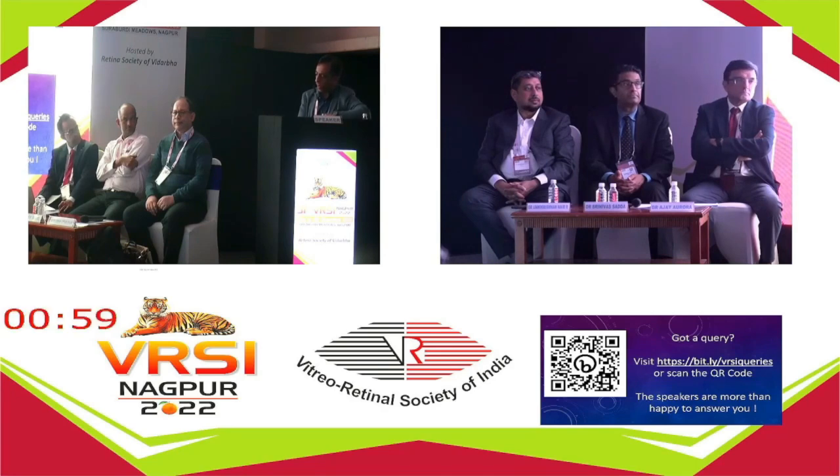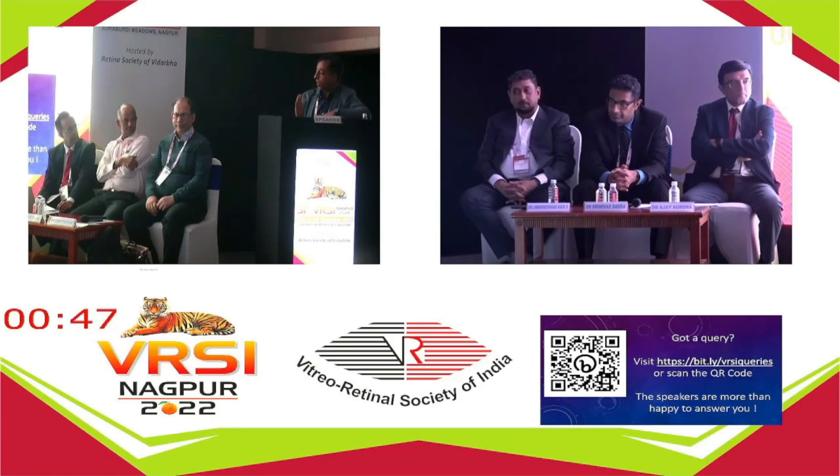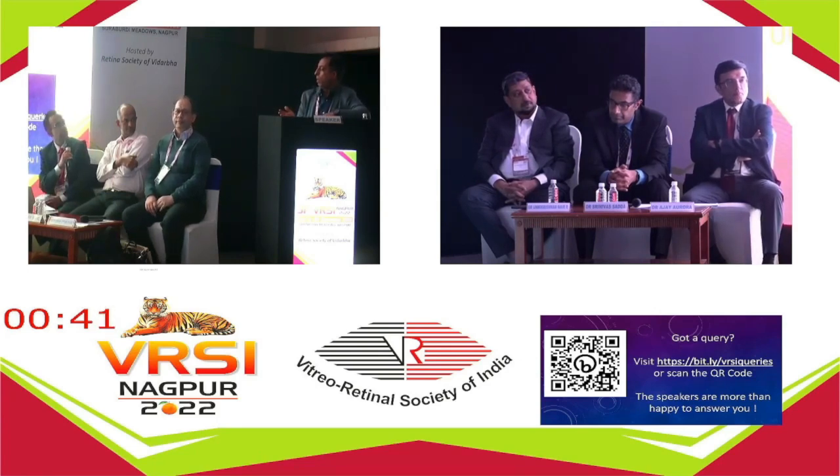CSCR, of course, you can see certain changes there, but it's not consistent across the board. I don't think you can pick up a site of leak on the retro mode that easily. We've tried that a lot in the past. I think Nidek had a retro mode machine separately. Prior to this, we used to use that, and we tried to do a lot of CSR on that, but we could not get consistency. But it's brilliant for drusen and these subtle excrescences, Best disease, all these things.